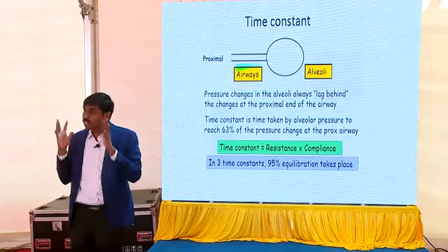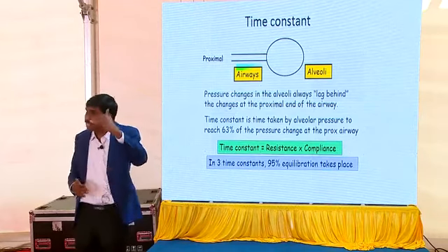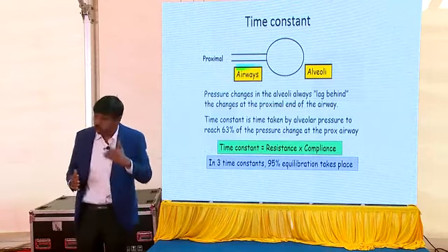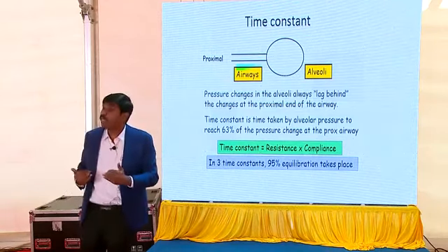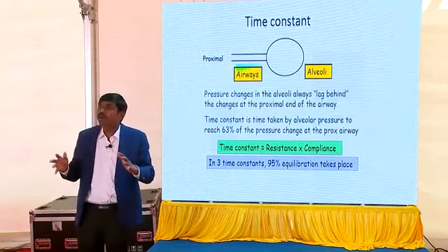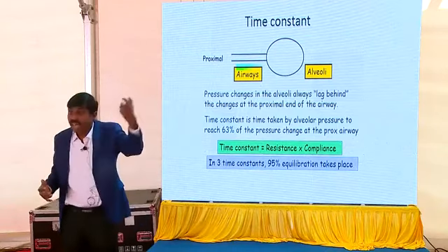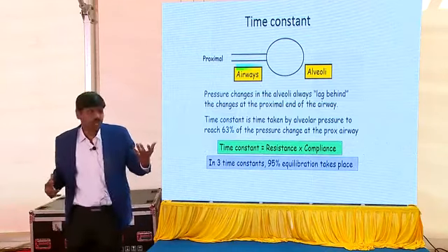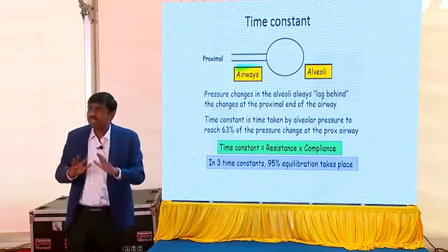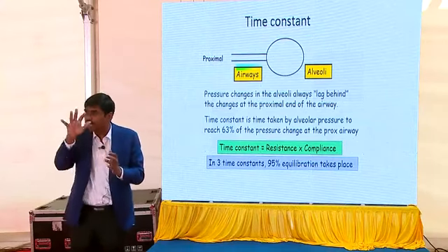If you're dealing with a very hard lung, like an RDS, sometimes you keep a little less TI. In more premature babies, sometimes you keep less inspiratory time. But again, in newborns there will be a lot of overlaps. We're not just talking about stiff lung; sometimes you have an airway problem in meconium aspiration or some other problem. But the crux is, if the lungs are very stiff, you are going to give a little less I time.